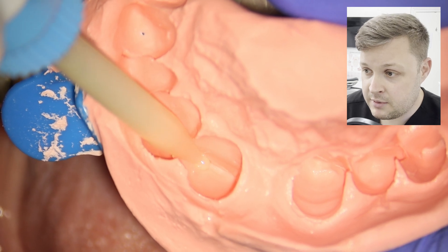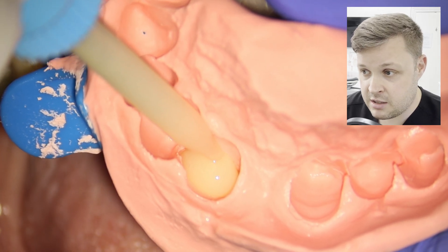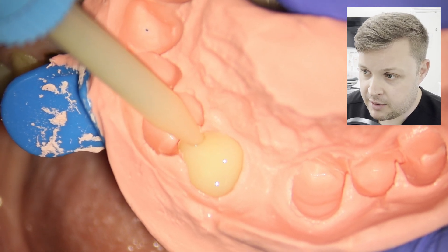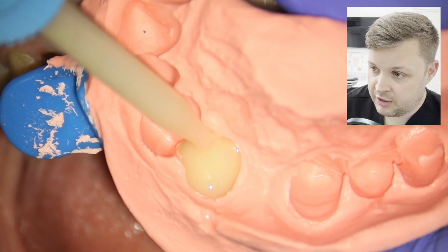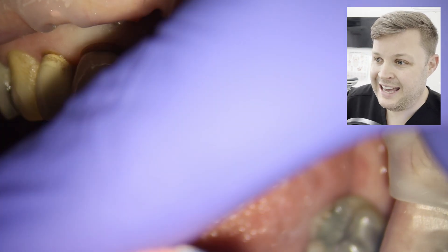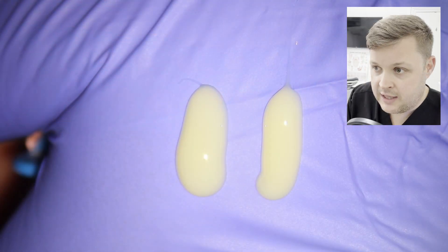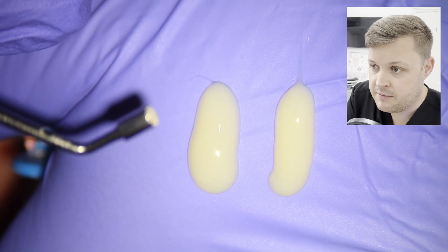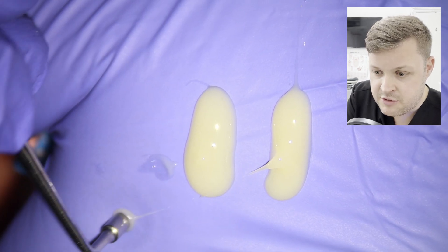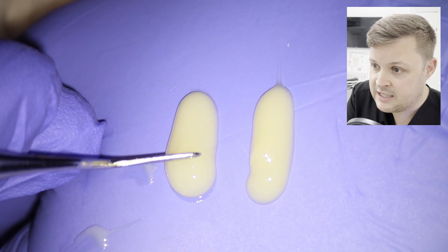Next we're going to construct a temporary crown. We're going to use the sectional alginate index we took at the start of the video, fill it with Luxatemp temporary crown material where the tooth was, and push it up into the preparation. I also like to squirt a little of the temporary crown material onto the back of my hand — that gives me an indication of when it's going to set.